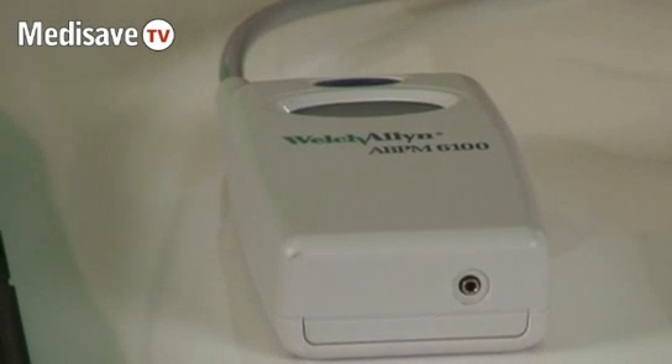Hello and welcome to a demonstration of the Welsh Allen 6100 Ambulatory Blood Pressure Monitor. This unit has been validated to the British Hypertension Society protocols and given a double A rating.